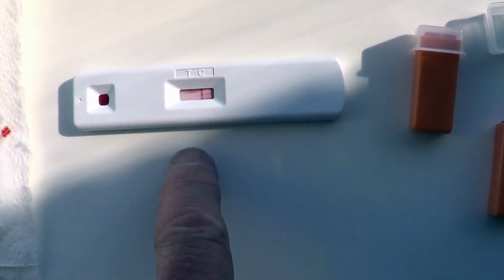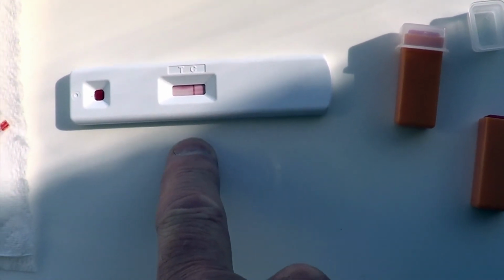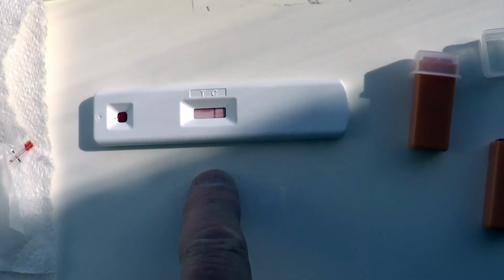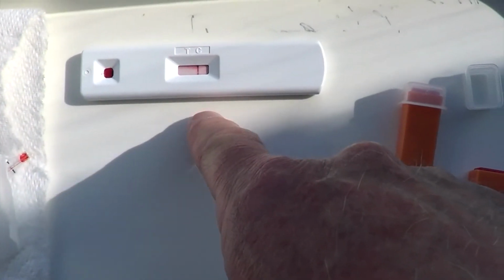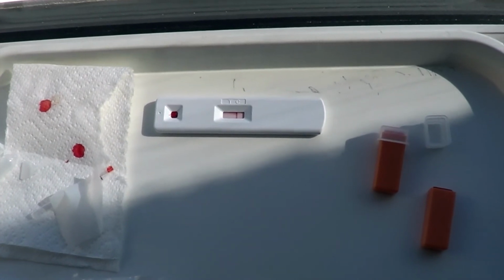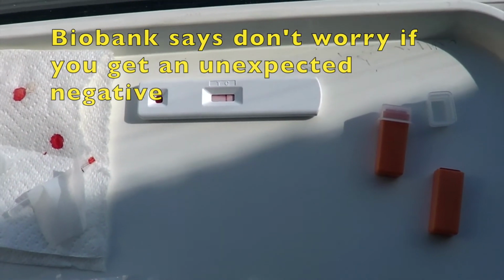So if I get a line there in 20 minutes time, it means I've got the antibodies in my blood to the COVID-19 virus, which I should have since I've already had the first vaccination. So hopefully I get another line. If I don't, I'll be slightly anxious about that, because it would mean that my vaccination maybe hasn't worked, or my antibodies have dropped an awful lot, too low to be tested.